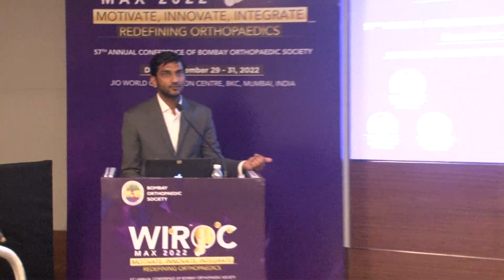Okay. And do you always keep your conventional set of instruments? It's always there, of course. To cross-check with the system, even intraoperatively? No, that has already been done. That's why they came out with the system, right? When they release a system into the market, they've already done this. Of course, if you have your individual paranoia, then you will do it for your initial cases and see. But most of this paper tells you that since you're able to achieve eventually what you're planning, then why do you want to cross-check again with your conventional jigs case to case?